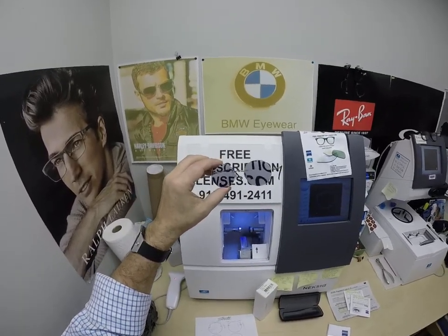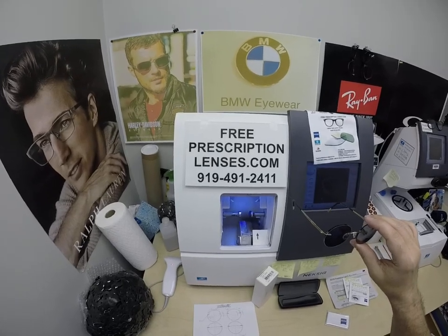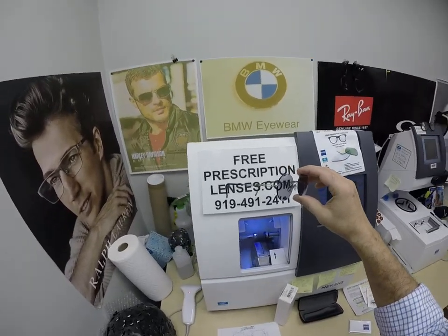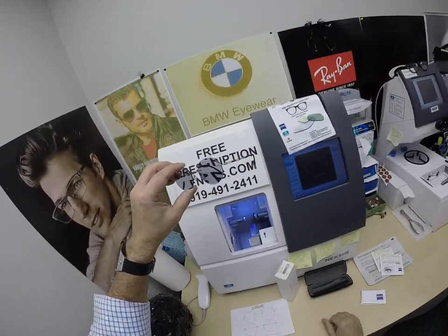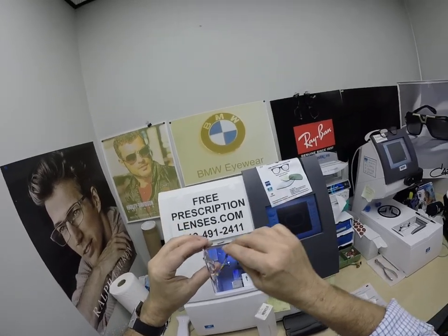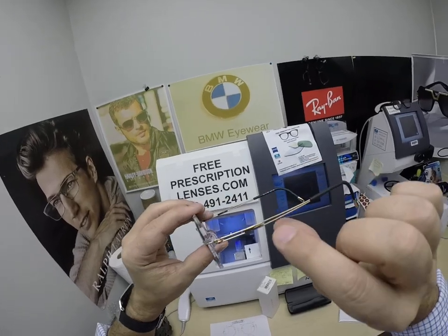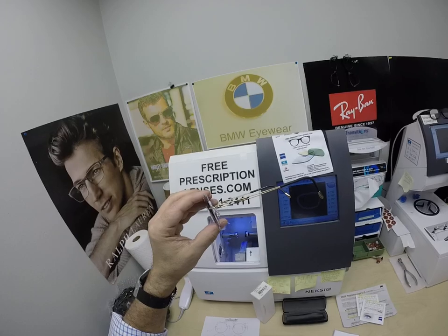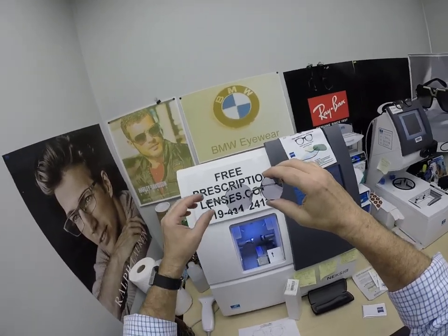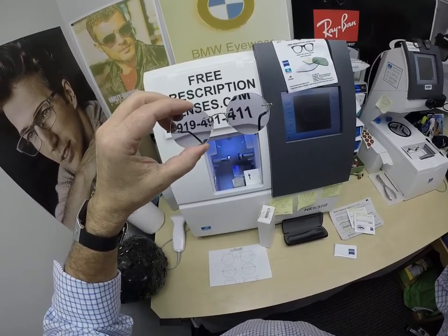Especially if you get the PhotoFusion Blue lenses, get either the DuraVision Silver or DuraVision Platinum anti-glare coating. If you have any questions, email me at the Contact Me page of the website, or call directly at 919-491-2411, which is what SpiderWeb did. You can also leave a question in the comment section below. Spider in Battle Creek, Michigan — thank you for the purchase of the Silhouette 5521, color 7630, gold finish with black temple tips, Zeiss Light D Digital Freeform Progressive Lenses, PhotoFusion Extra Gray, and DuraVision Chrome Anti-Glare.